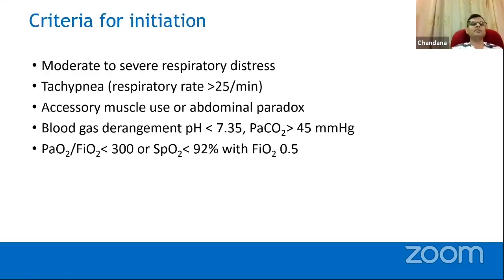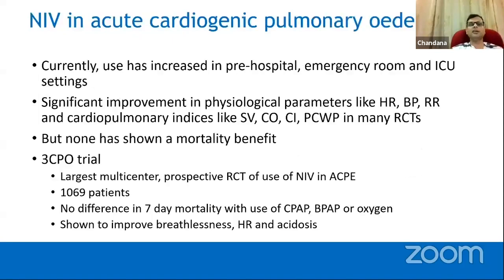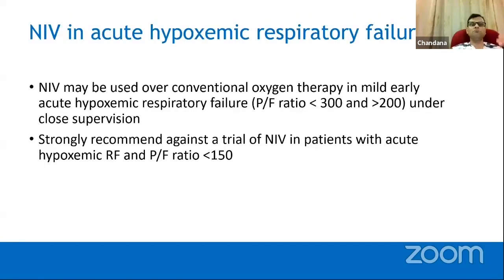There are so many indicators. I'm not going to talk about indications, these are kind of boring, and you can decide when the oxygenation fails. You can read about these things. And generally, this is well tested for hypercapnic respiratory failure, like in COPD. I'll just skip these slides because at the moment we are trying to apply these things on COVID patients. So basically, it's not really indicated in hypoxemic conditions, not proven to be beneficial, but there's nothing else we can do at the moment. So we'll have to use it.